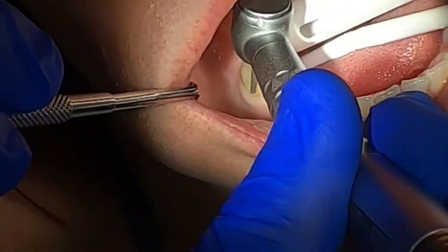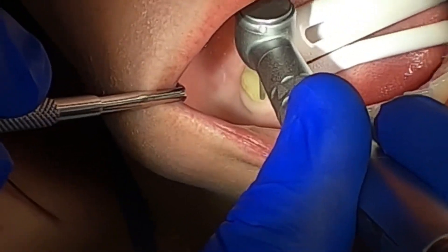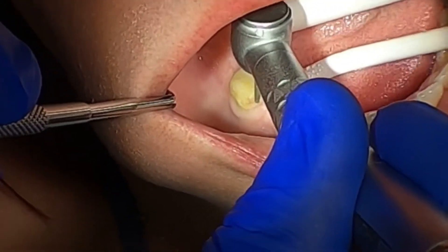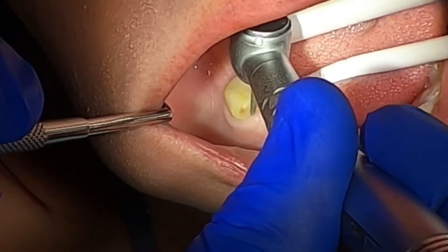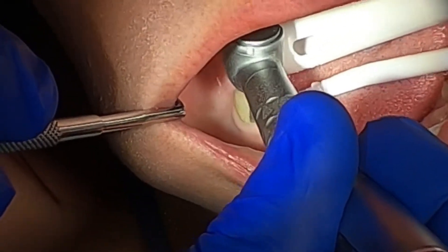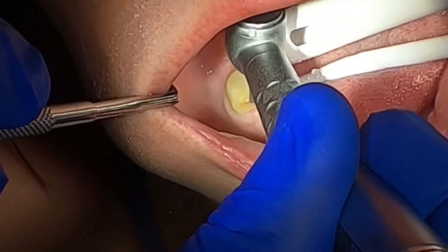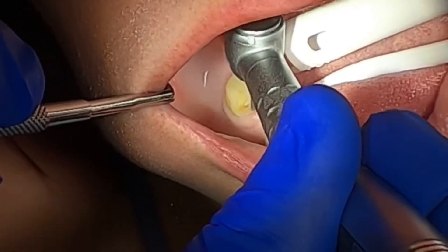Thanks for tuning in again. This is another point-of-view video recording of a bridge preparation from tooth number 28 to tooth number 30. The angulation is pretty close — it's from a head-mounted camera with 3.5 magnification ocular, so it should be pretty accurate.